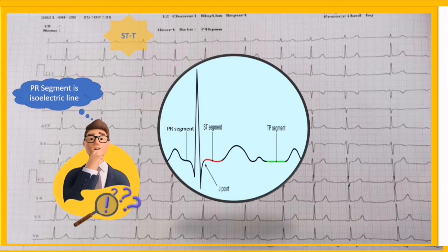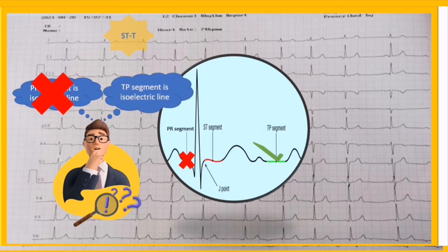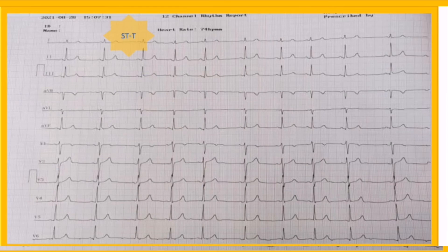There is a fundamental misunderstanding about the baseline. Some think that the PR segment is the baseline and we must compare the ST segment with it, but that's wrong. The truth is that the TP segment is the isoelectric line, and ST changes are determined using the TP segment. Here, as you see, there is no significant ST elevation or depression.